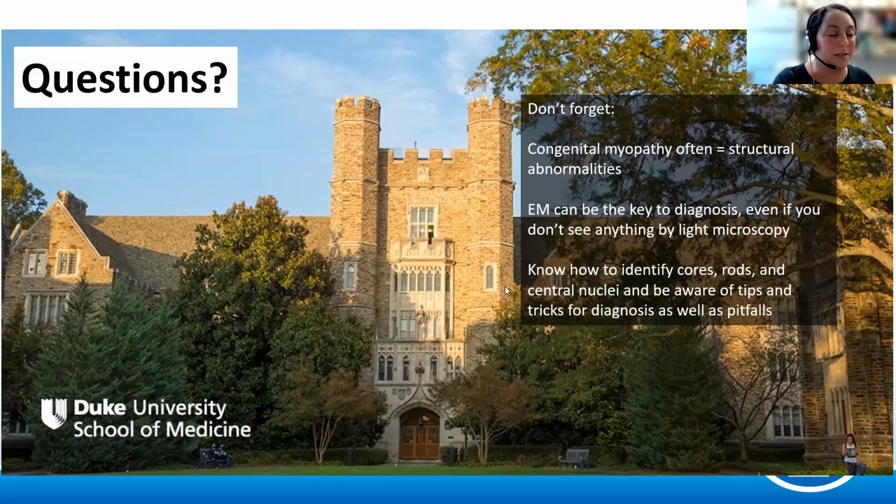But the IHC is easier to do. While there is overlap, I don't find that to be enough of a problem that I would want to go back to the ATPases. I really, really like having the antibodies. And then Dr. Cohen says, for what it's worth, we do both fast and slow on one slide with different chromogens. Yes, I have seen that before, and it's beautiful using a brown and a red chromogen, and then you can look at it right there side by side. Pretty lovely.